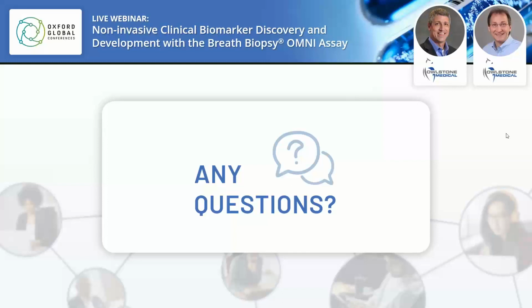Thank you so much. And I believe, Jeff, this question is for you, and if you're able to turn on your webcam: is it possible to use the device at home? So right now it does need to be used in a clinical setting. It really is designed for discovery, but we do have other technologies that may be more amenable to point of care testing that get further along in development.